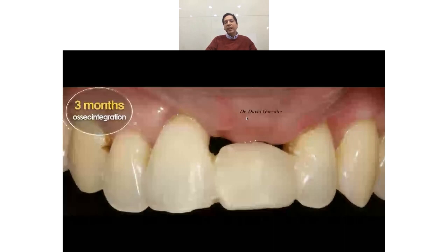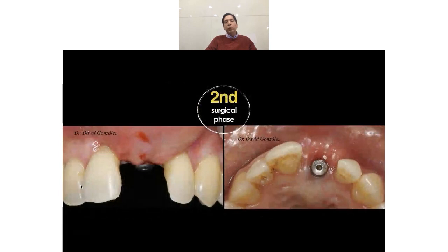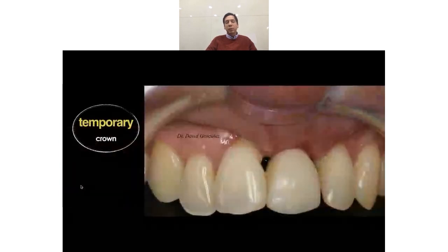3 months later, this is the aspect. I have a lot of soft tissue in here. We can see the radiopacity of the regenerated bone in here. And we do a second surgical phase. And this is the temporary crown.